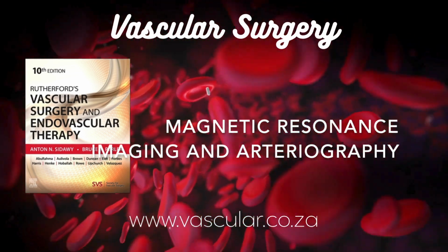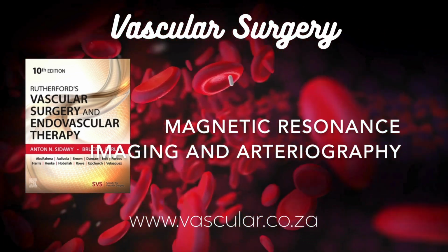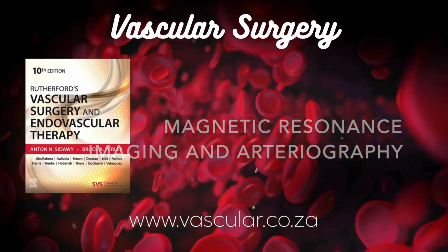So some people can get scans now. Yes. And even for some older non-conditional devices, specialized centers have developed strict protocols to scan patients safely if there's a compelling clinical need and no good alternative. What are the risks with older devices?